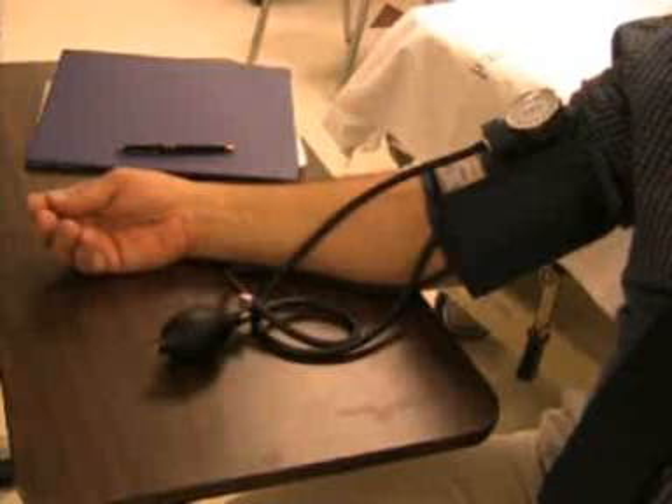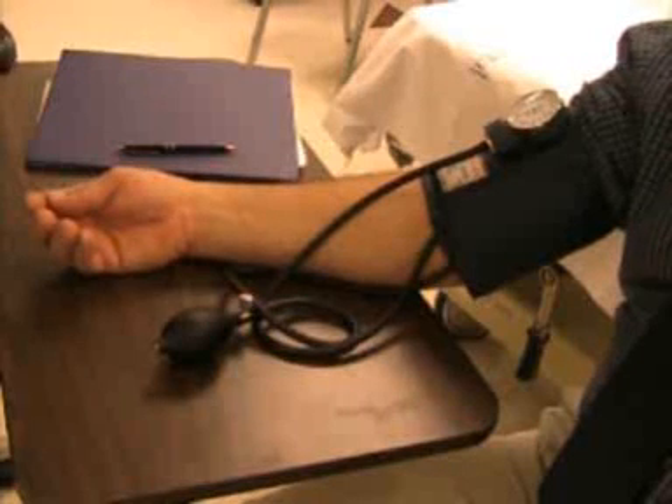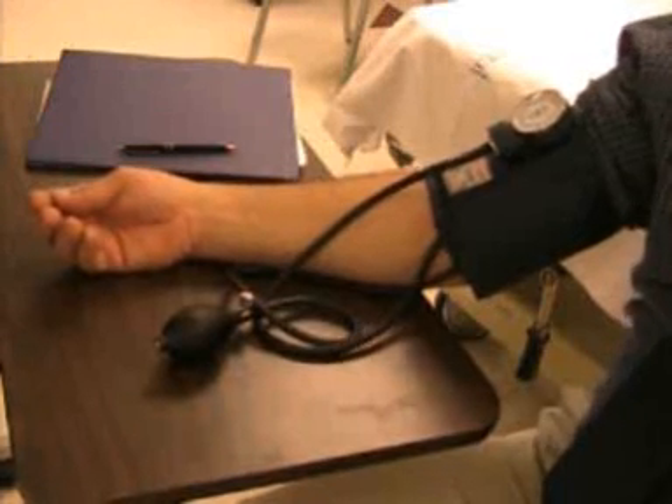Write down your blood pressure, time, date, and which arm was used. 'Blood pressure is good, sir. 118 over 80.'